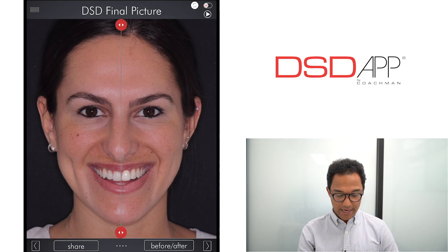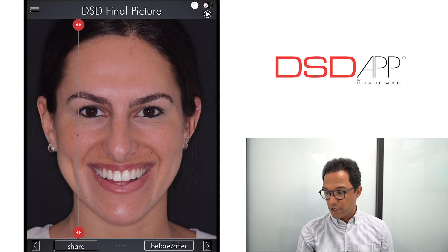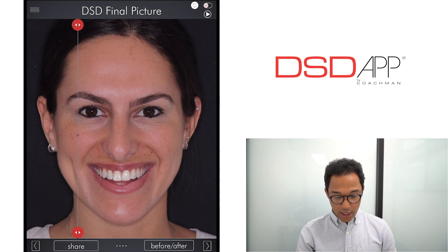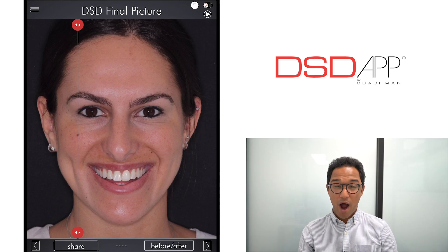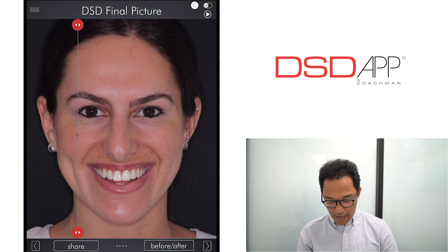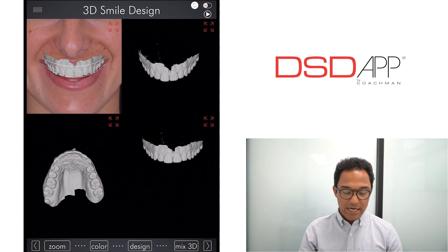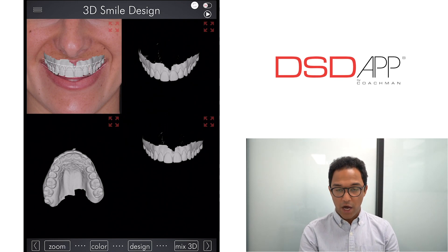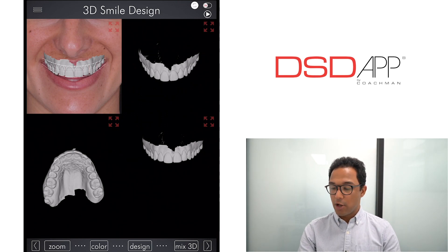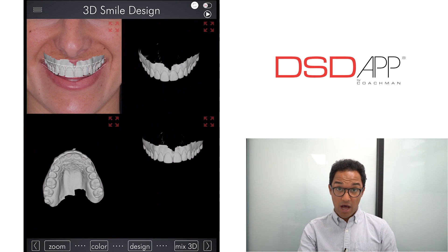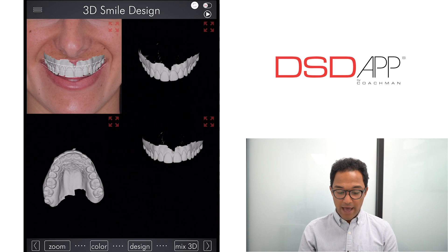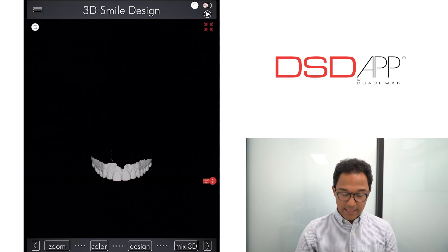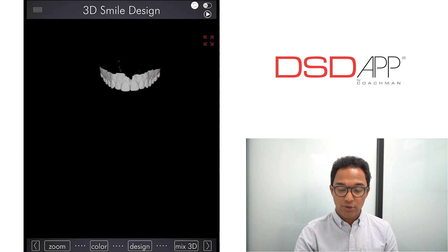Let's finalize the case. Here we have the before and after — you can see there is already a huge aesthetic change. However, we want to proceed to the best part: doing a mock-up using the DSD app. Let's tap Next. Here you're able to see four screens: the frontal facial with the smile on your top left, the STL positioned as a 12 o'clock picture, the occlusal view, and on your bottom right you have the dynamic view, which lets you rotate the STL in any direction.